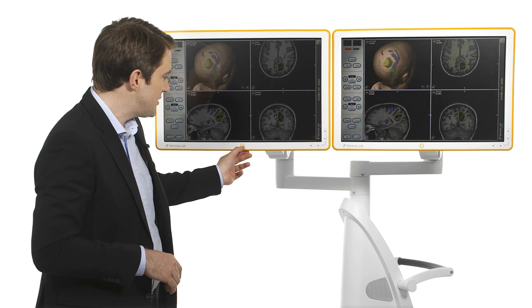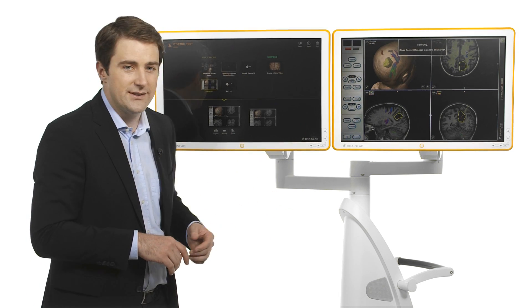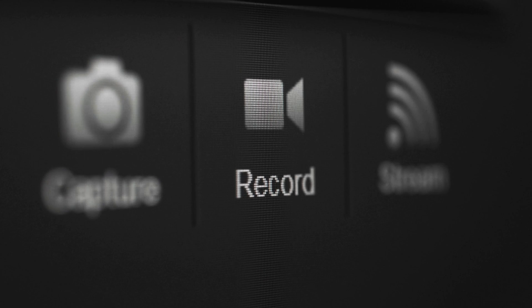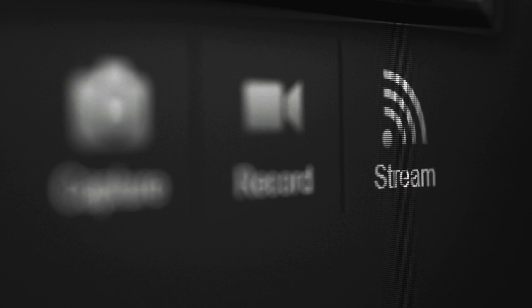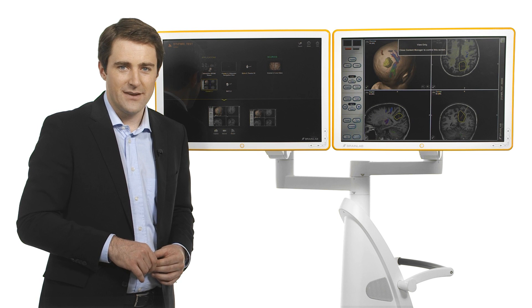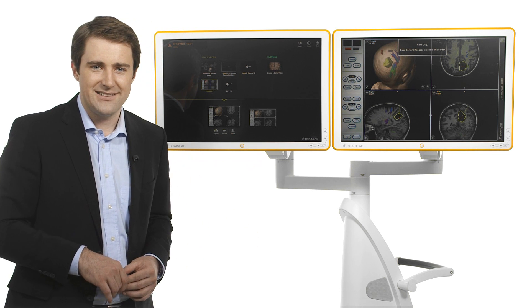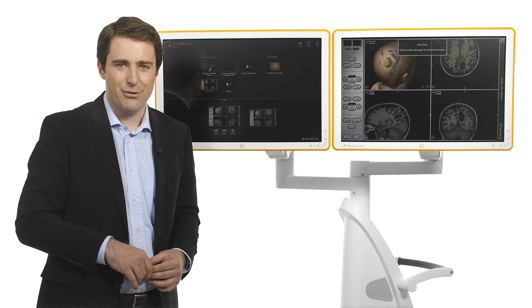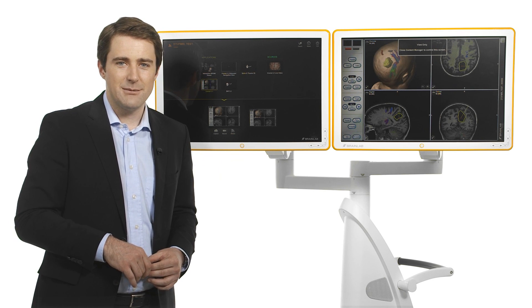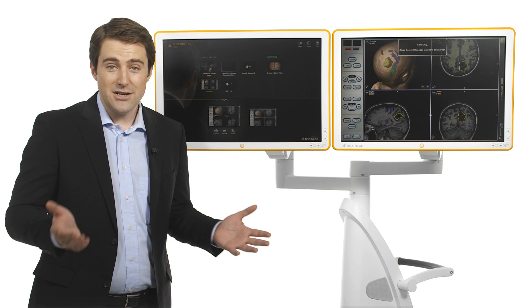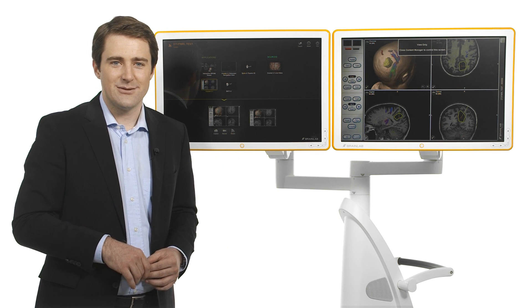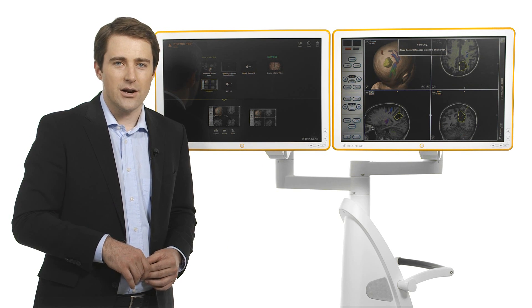For record keeping or educational purposes, Curve also takes screenshots, records video, and streams to any linked computer within the hospital network. For even more software functionality both inside and outside the operating room, Buzz Digital OR integrates seamlessly with Curve. Much like its hardware, Curve's software is transforming navigation in the OR.